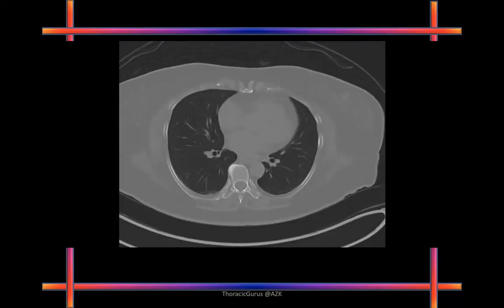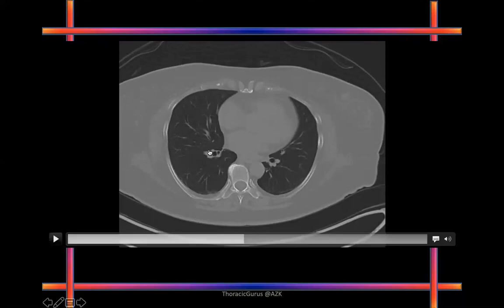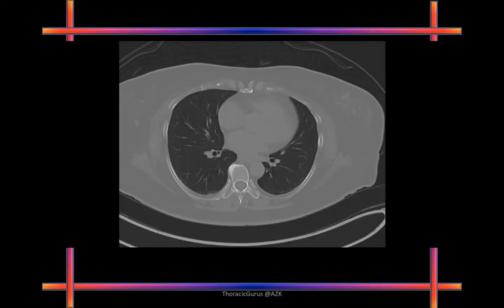Follow the rest of the bronchus. What do you think this is? This is the lower lobe bronchus with the apical segmental coming up and the common basal coming up. So the apical segmental going this way will become apical segmental, and this going here will become common basal. Did you understand that? It's as easy as that. Yes, sir.